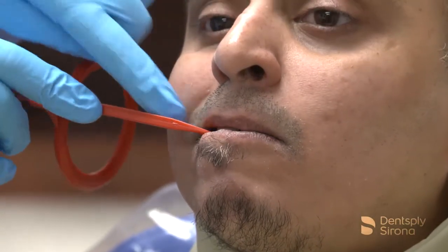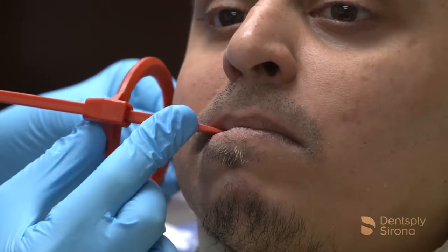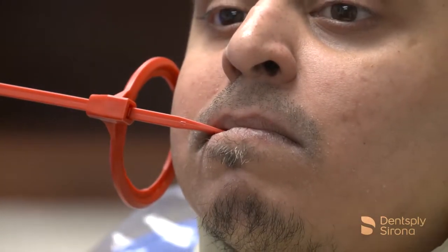Position the holder in the patient's mouth and slide the ring close to the patient's face. Align the x-ray tube to the ring and take the exposure.